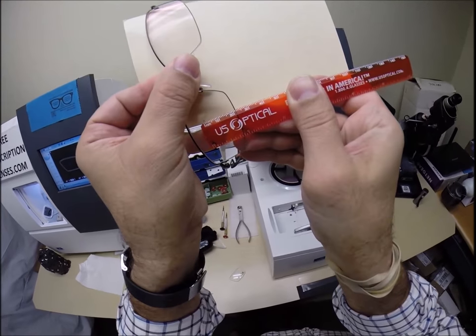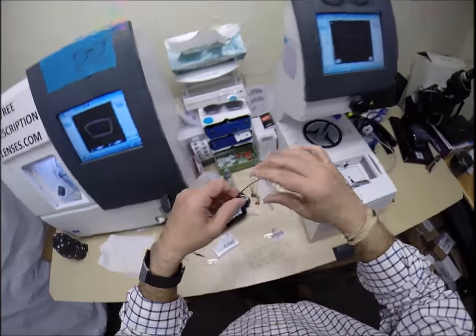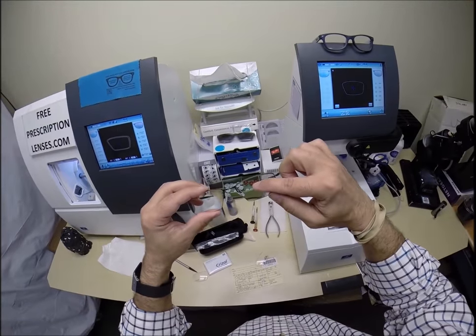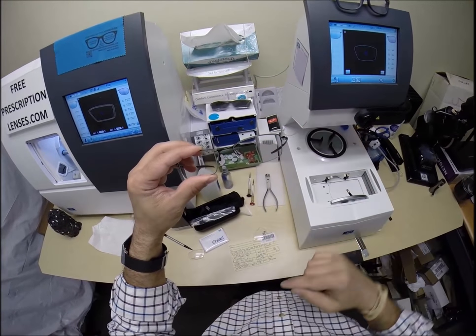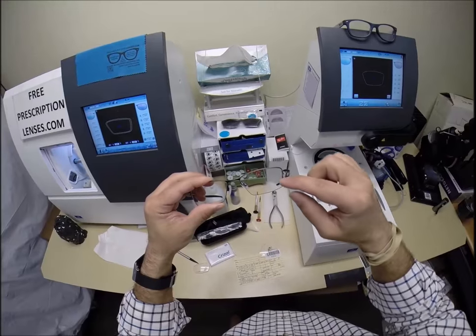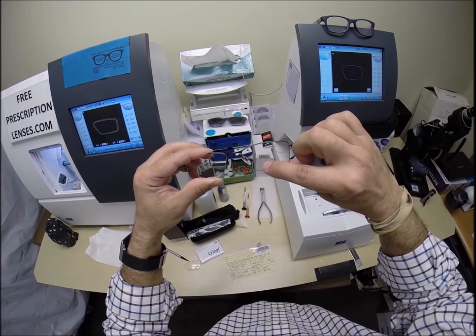It's called a progressive lens because once you start looking down through this point, the magnification progressively gets stronger and stronger — imagine walking from the shallow end of a swimming pool toward the deep end, as it gets deeper and deeper, the power gets stronger and stronger.